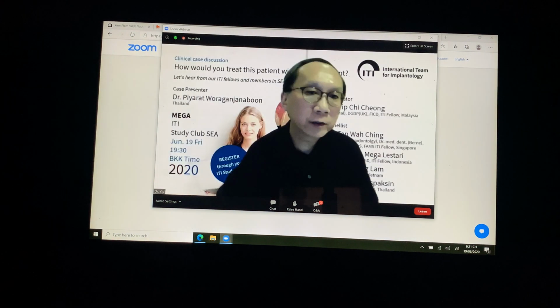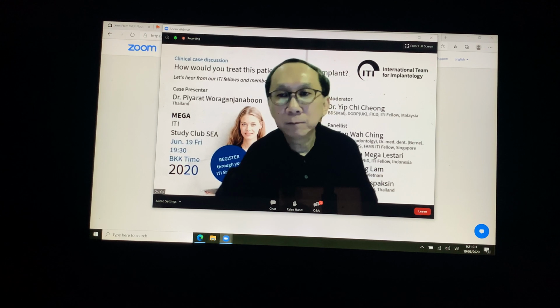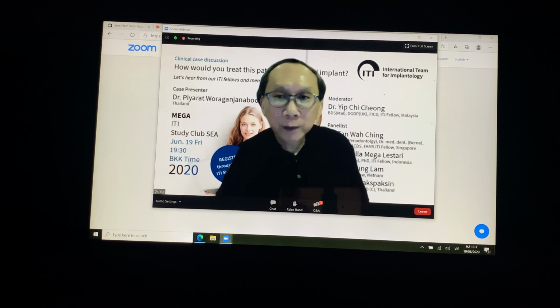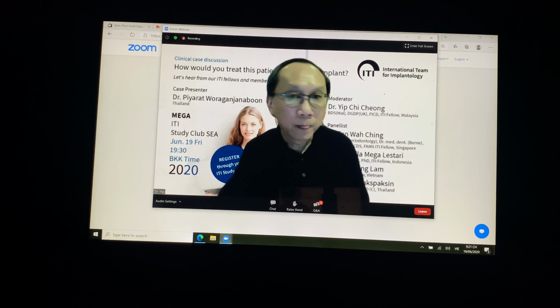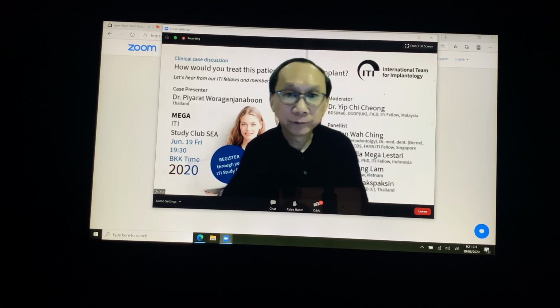So let me just compare your immediate placement and an early implant placement. In an early implant placement, post-extraction, it's 4 to 6 weeks, followed by implant placement, and you wait for the osseointegration to happen. So Lam, how long do you wait to restore your early implant placement?